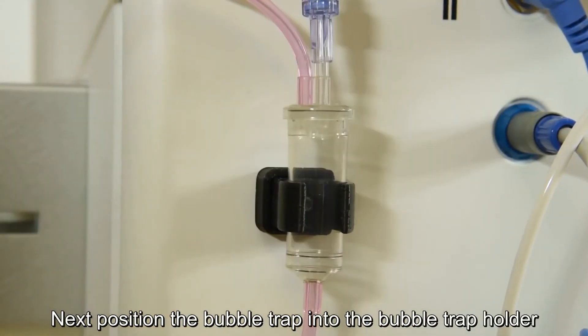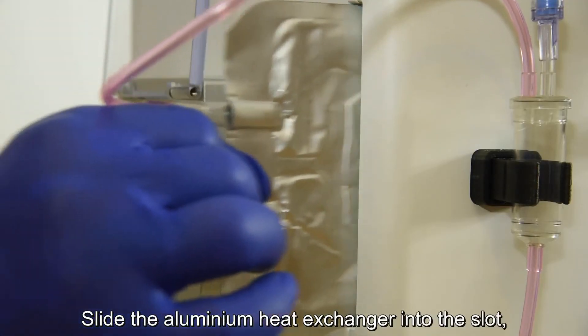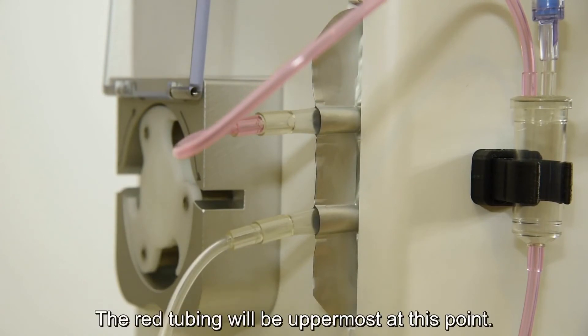Next, position the bubble trap into the bubble trap holder with the blue valve pointing upwards. Slide the aluminium heat exchanger into the slot, being careful not to damage the foil and ensuring it is fully inserted. The red tubing will be uppermost at this point.